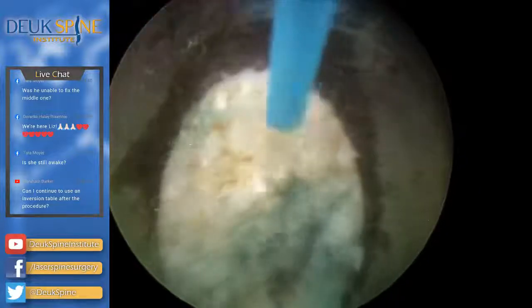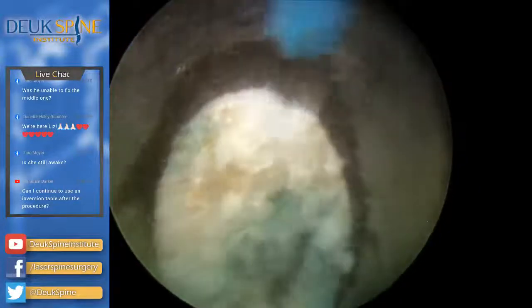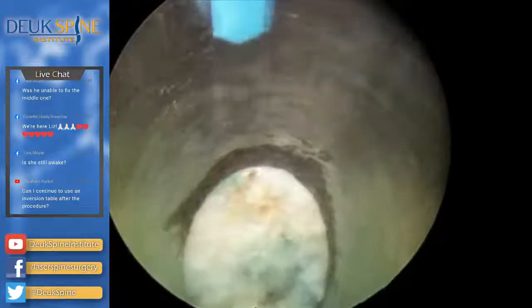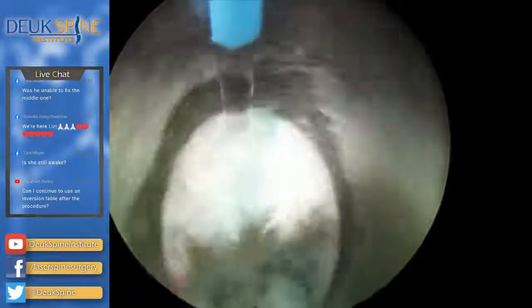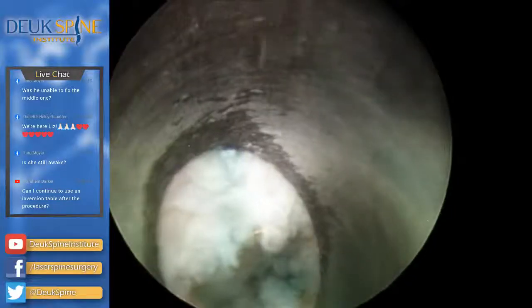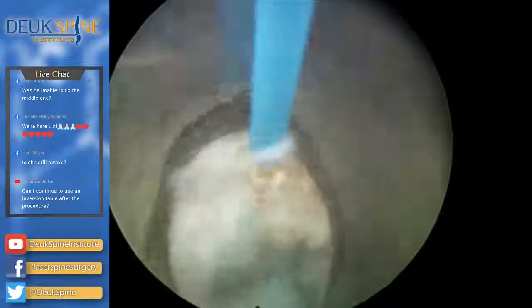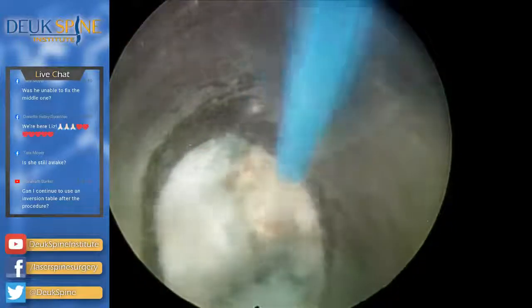This is that thick band of scar tissue I was talking about earlier when we did the discogram and you couldn't see the tear, because this is partially healed. There's a tear right there. You see the blue? Maybe we couldn't see it with the discogram, but there's definitely a tear there. That's where all the pain is coming from, this tear.